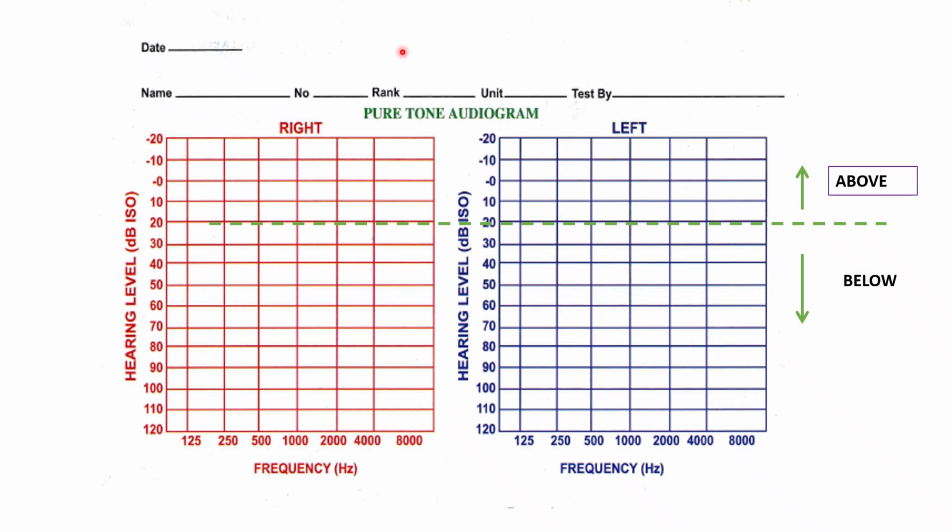Whenever we are filling in the audiogram, mention the date, the name, and the test.